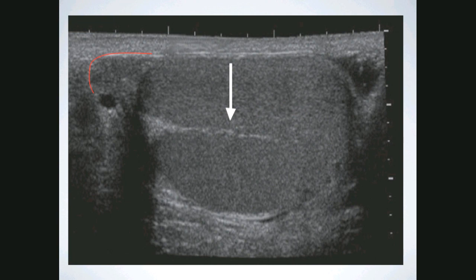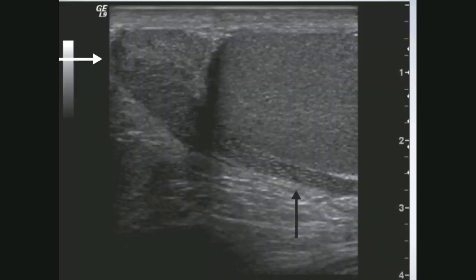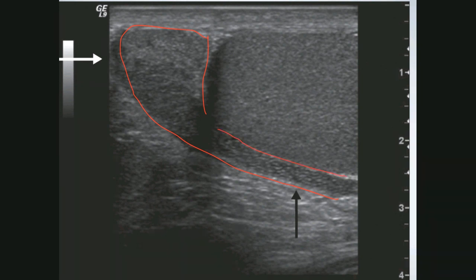Here we can see the epididymis — just the head, with possibly a small cyst in this picture. This is the mediastinum testis shown here. On the next picture here's the head of the epididymis, and we can see a little bit of the body — an unusual finding unless it's enlarged. I don't think this is enlarged; they just have good resolution, but that's the epididymis.